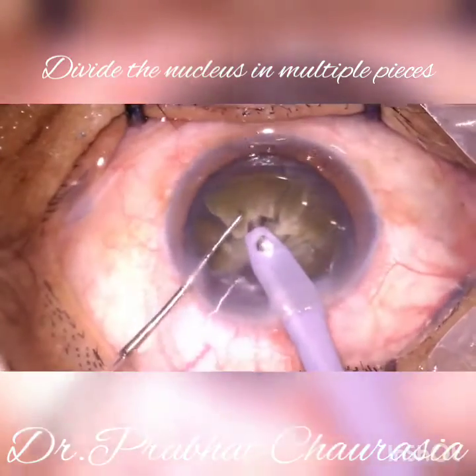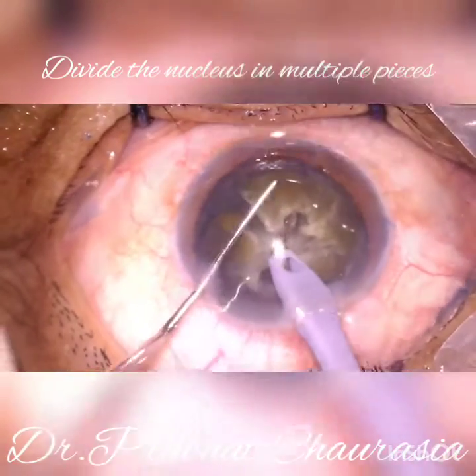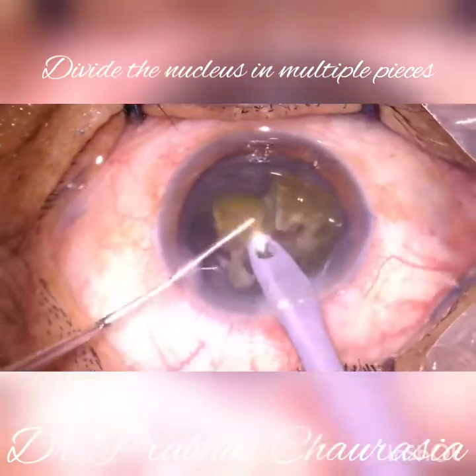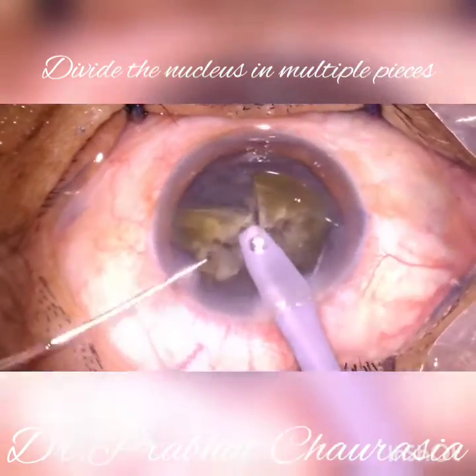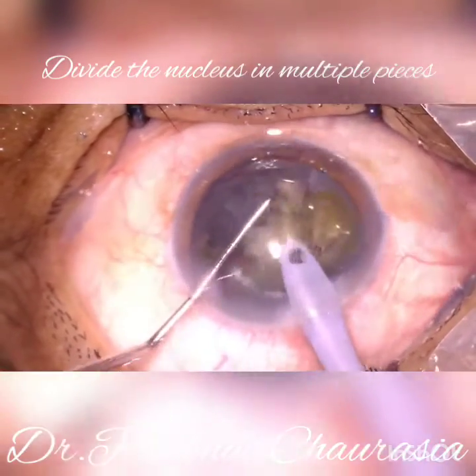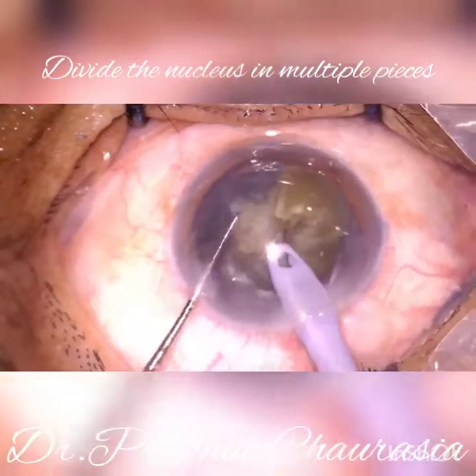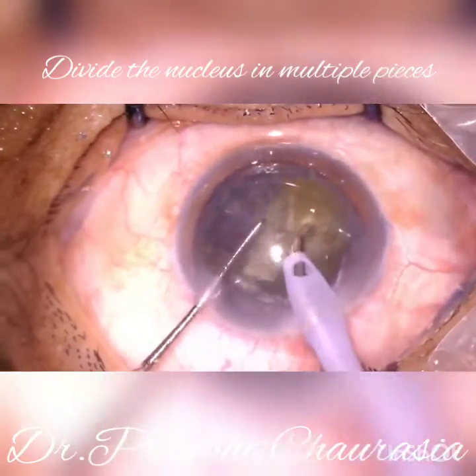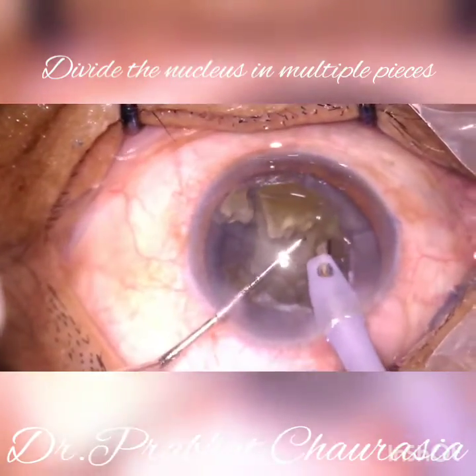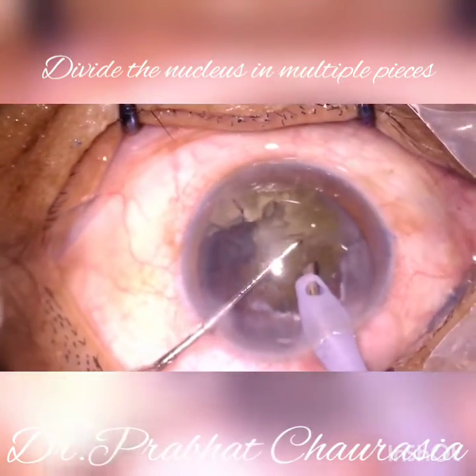Always remember: use phaco energy at the correct time, and use phaco energy only for emulsification. Unnecessary wastage of energy in the anterior chamber is not good practice.